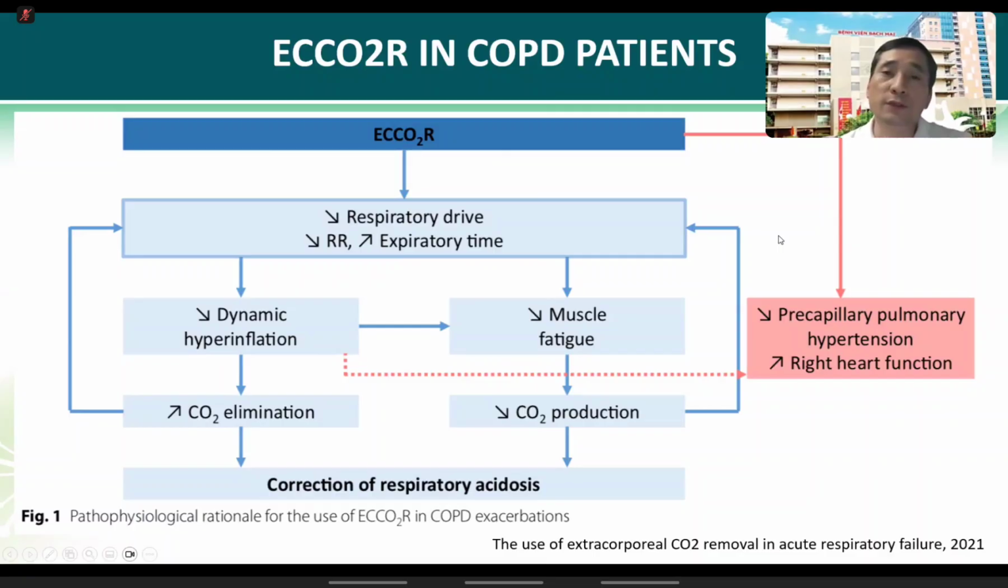Okay, so why do we use CO2 removal for COPD patients? It is easy to understand because the COPD patient's CO2 level is always high. Of course, in stable COPD, you see the pH level is in the normal range, but in exacerbation of COPD, the pH goes down.